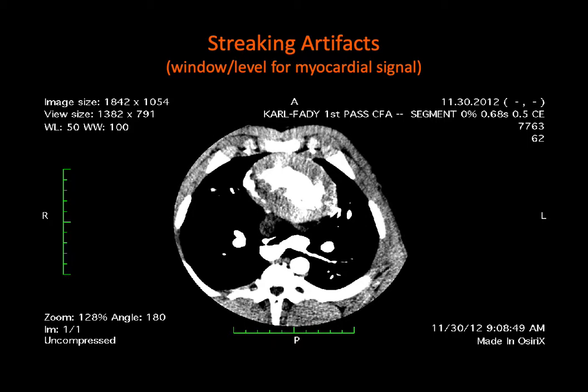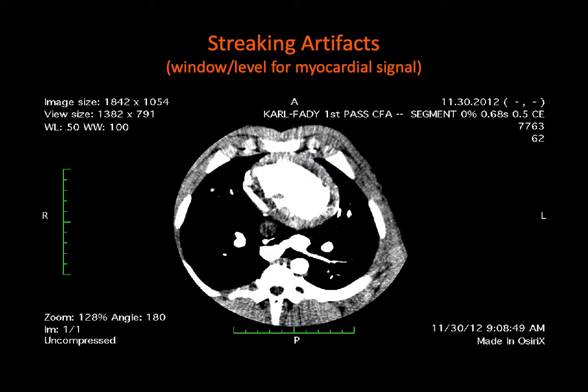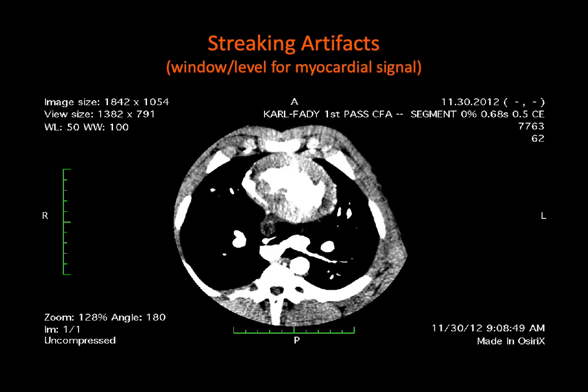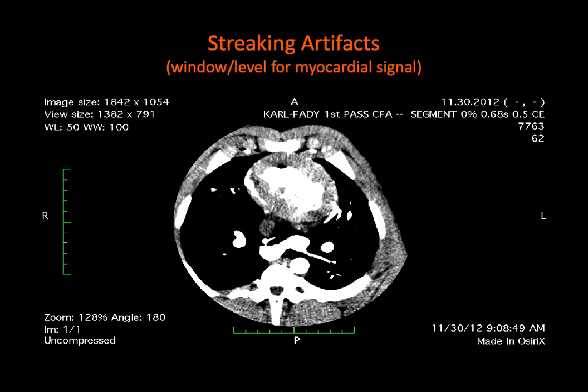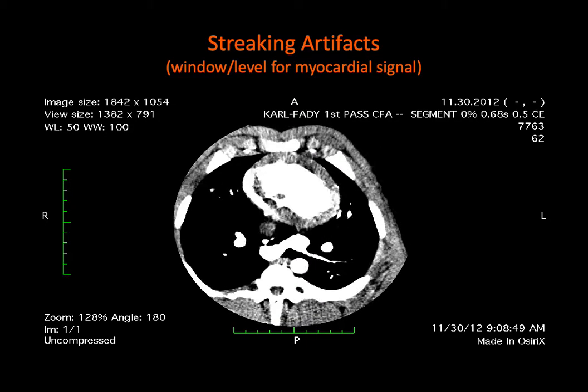Right? So now the problem is if you take a picture of this piece of myocardium every 5 seconds, and your gantry is in different positions, you know you're going to be going through basically this halo ringing effect on top of your signal. And so how do you account for it, or how do you take it out or decompose it out of your signal?